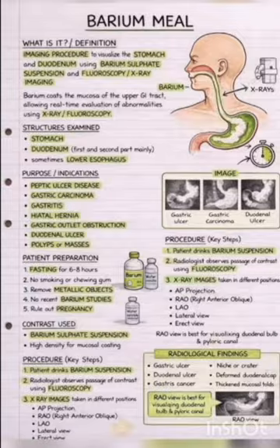The passage of barium is examined by the radiologist under the fluoroscopy machine. After, the patient is rotated clockwise 8 to 10 times for good coating on the stomach mucosa. The radiologist observes the flow of barium sulfate and air, from the effervescent powder, in the stomach under the fluoroscopy. Then the patient is turned into the left posterior oblique position, also called LPO. In left posterior oblique position, the air fills the pylorus and duodenal bulb. Spot film is taken. Then additional filming.